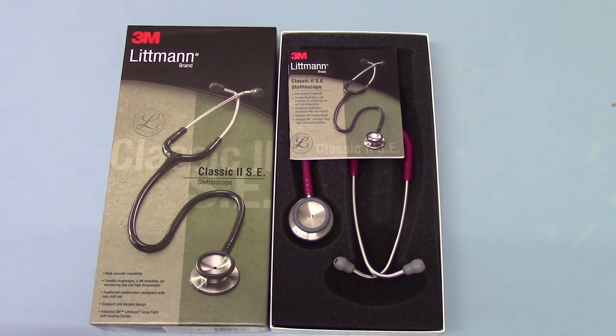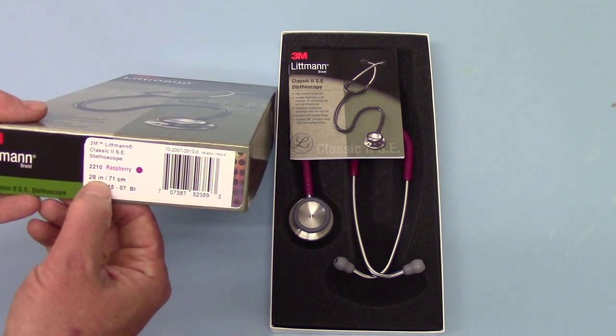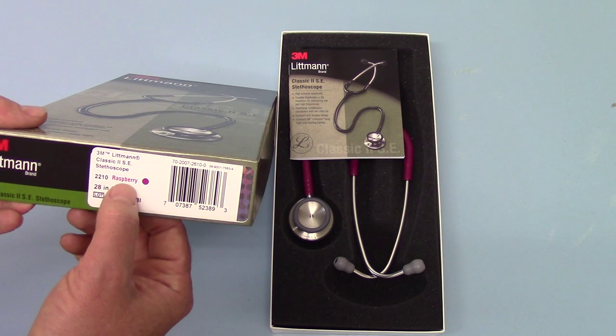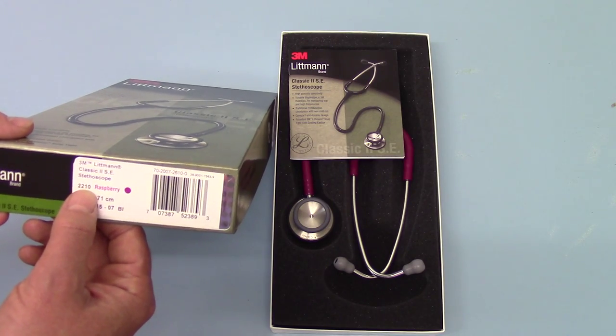Compact and durable design. The tube length on these is standard 28 inch or 71 centimetres. This is the Classic 2 SE with a raspberry tube, and the catalogue code from Littmann for this colour variation is 2210.